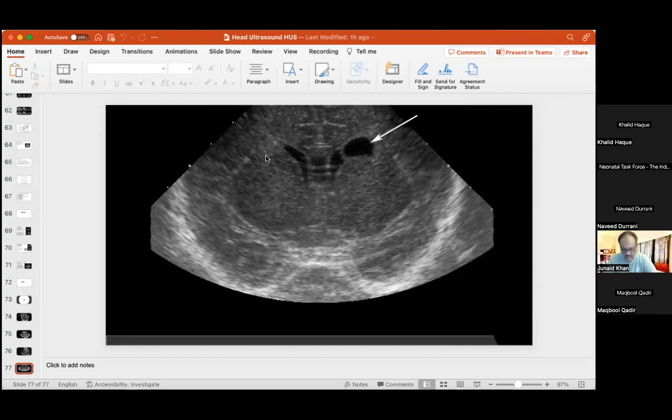And if you start doing the ultrasound, it is always better that you have a senior or at least the radiologist who will guide you, because doing an ultrasound has certain prerequisites as well. The baby should not be disturbed. You should not press the probe too hard. The gel should not be cold. Of course, hygienic measures have to be taken, clean the probe, and keep the baby warm. So first, my advice would be, if you go through what I will share in the group, identify the structures and see the pictures first, try to orient yourself, and then slowly start learning.